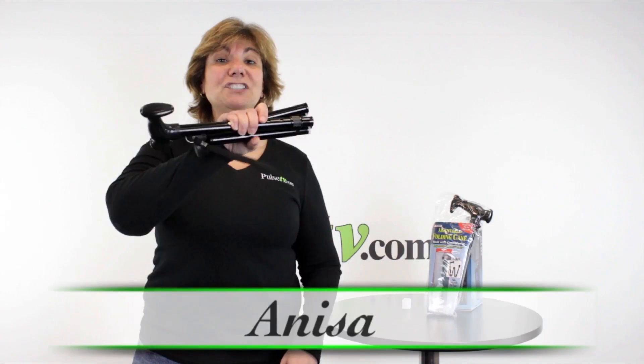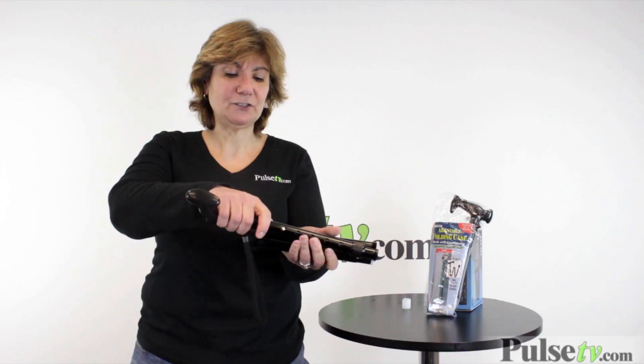It's Anissa bringing you the adjustable folding cane. Right here is a full-size cane. Look how easy this is to expand.